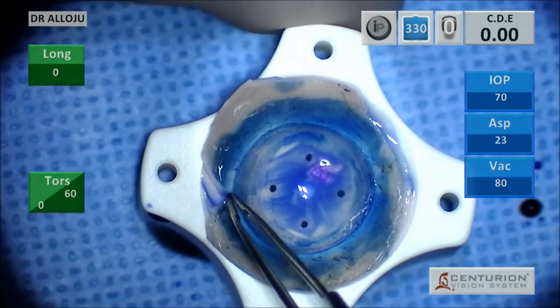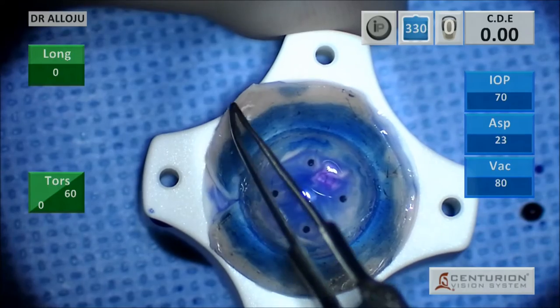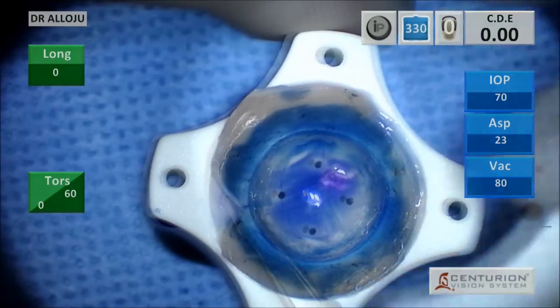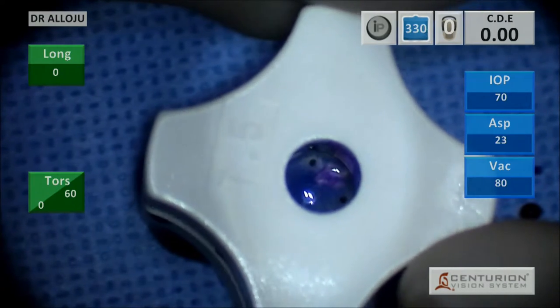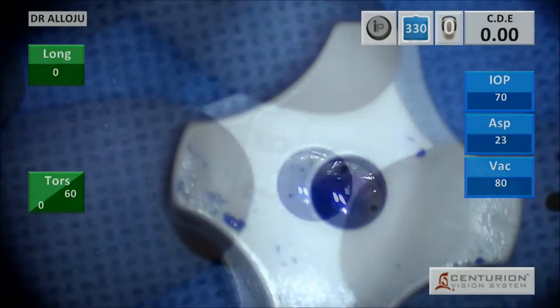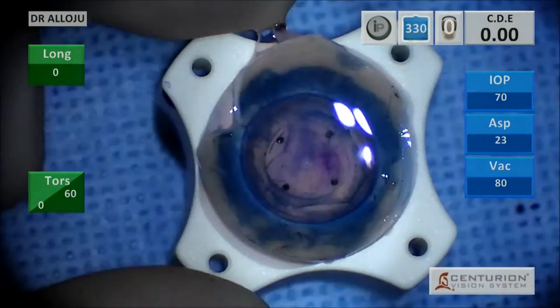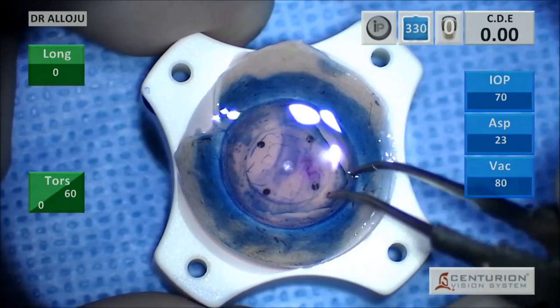So once that segment is done, I align the center of the graft with the four marking holes there. Once I've got a good alignment, I use a 7.5 Barron Hessburg non-vacuum trephine to punch through. Once I've punched through, I've added some of the Optisol back into the solution and come up.